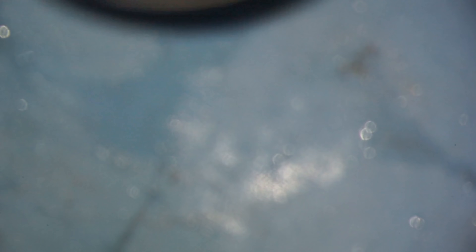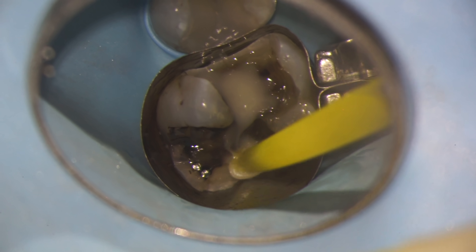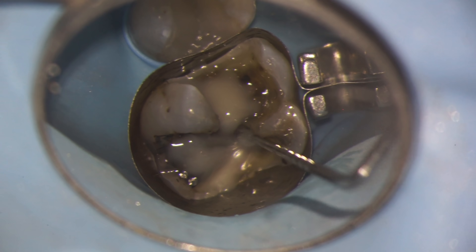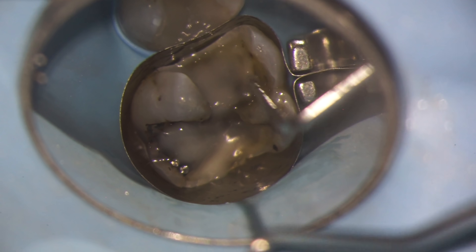We're going through the bonding process to make sure that the foundation we put in is nicely secured. The foundation comes out as a fluid material, but as soon as we set our light on it, it actually becomes rock solid. I like to make sure that the first layer is really thin and that it covers the entire floor of the tooth — that way we get a really good seal and less sensitivity.